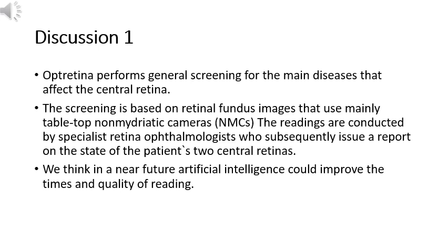Unlike other publications that aim to replace the human reading, we would like to explore future models based on the idea that a hybrid reading, or the use of artificial intelligence, AI, as a diagnostic aid tool, can, at this time, be a better solution for both guaranteeing the quality of the readings and decreasing costs and time invested, while also causing fewer ethical or legal problems. However, when working with images from different types of cameras, and even non-retinal fundus images, studying the image quality is even more important.